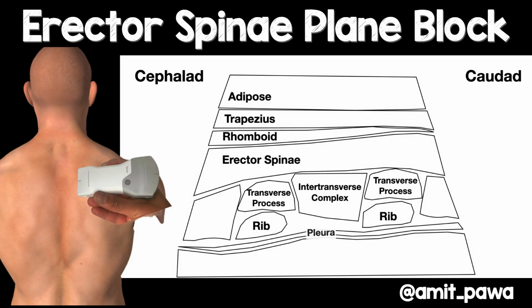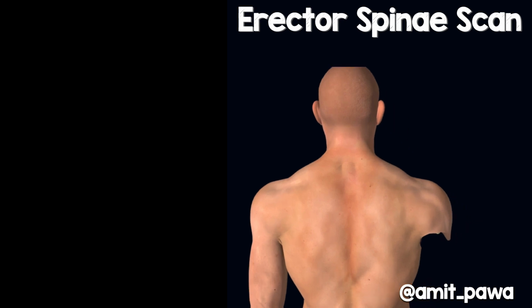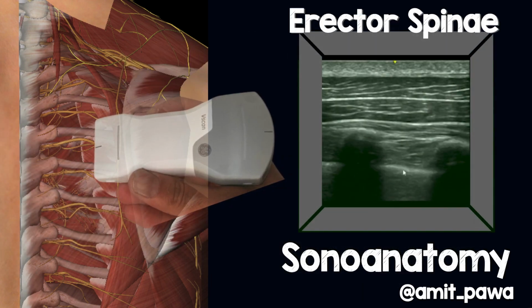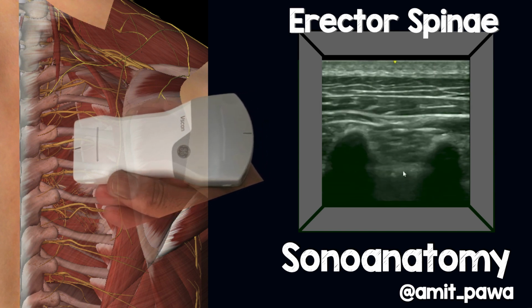Now, according to that consensus guideline, as long as you can identify the erector spinae muscle and the transverse process, you're good to go. So now let's have a look at what that scan might look like. So if we remove the skin and look at the tissue below and then apply a probe to that, have a look at the ultrasound machine on the right. You've got curved shadows of the ribs and the pleura, the cursor's on the pleura now.